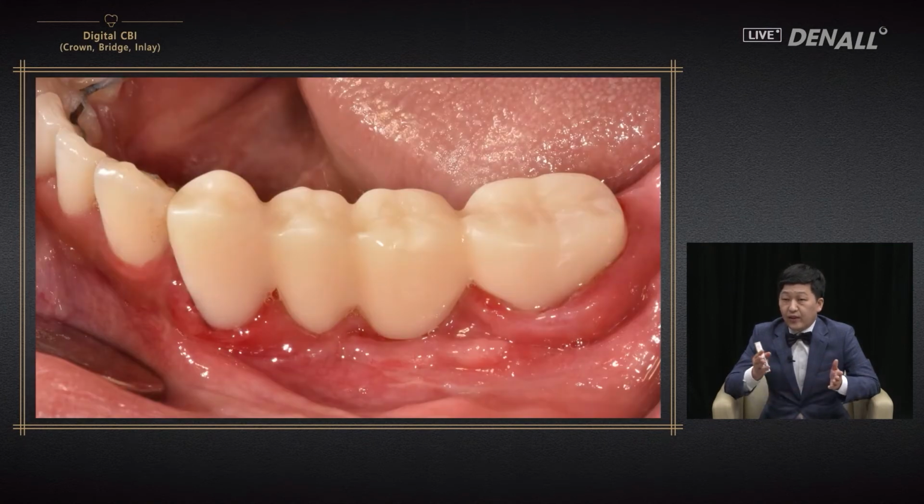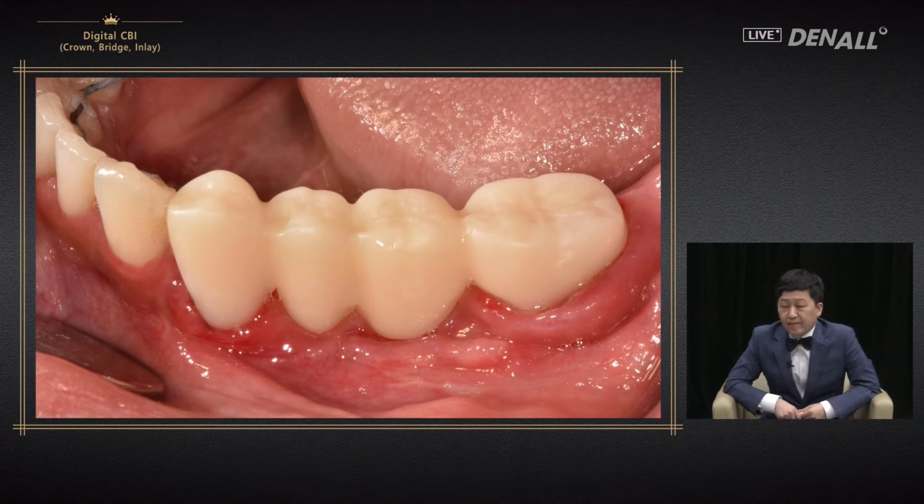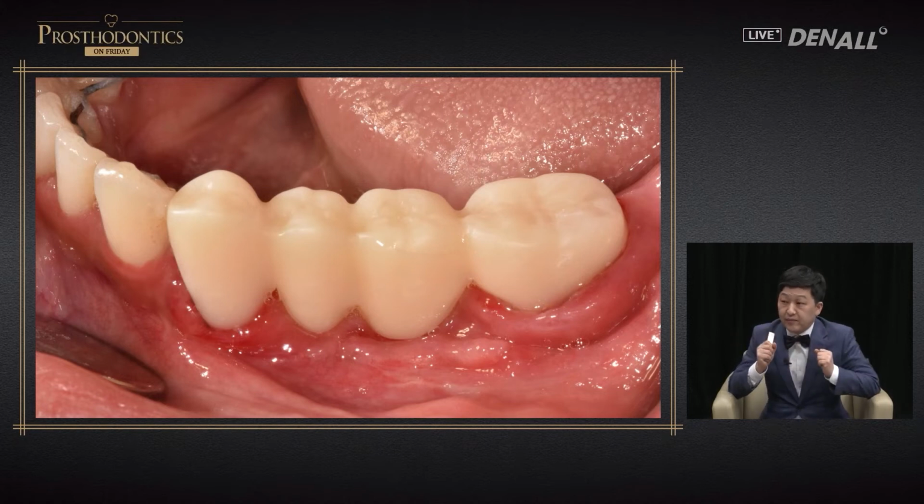Temporary crown has been designed like this. It was a long bridge. There was a possibility of occlusion being too high or low, so I used temporary to check the design. I made temporary crown using PMMA and I looked at it long and hard after setting it, but something didn't really quite click. In doing prosthesis design, if there's no major issue with the crown that has been designed with PMMA, you can just print it out exactly the same using zirconia, but the gingival embrasure space was too tight and oral hygiene was difficult to maintain.